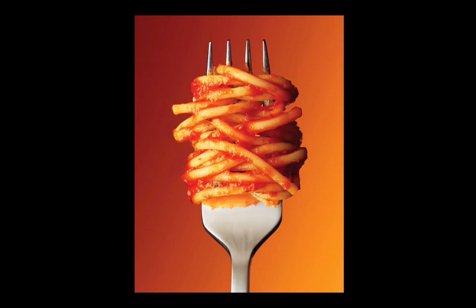So this is a shout out to all the parents out there. You know how hard it is to get your kids to eat spaghetti and not drop it all on the floor, right? You gotta teach them to twirl it up onto that fork. Well, holding your ultrasound probe, it's exactly the same way. Before you get your carpal tunnel muscles all revved up from doing tons and tons of ultrasound, you're gonna need to hold the probe in one hand and then grab it with the other hand and twist it so that you don't lose the appendix as you're rotating on it.